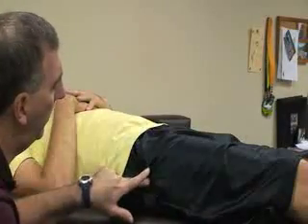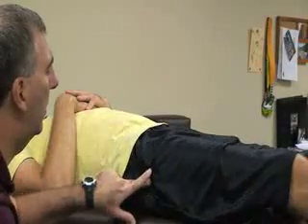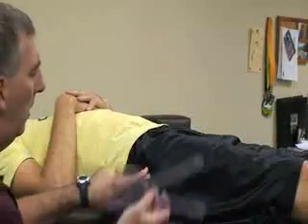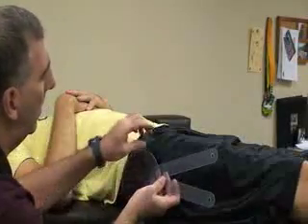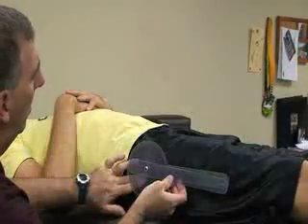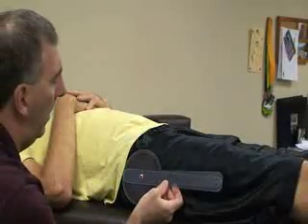I'm going to try to locate his greater trochanter on his hip. I may ask him to internally and externally rotate the hip just so I might be able to feel it a little bit better. Once I've found it, I'm going to go ahead and align the center or the fulcrum of my goniometer on that.